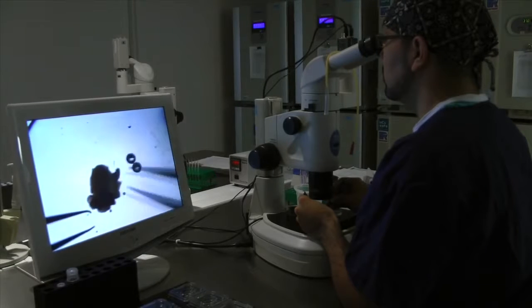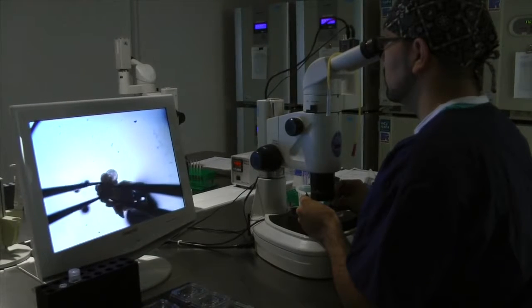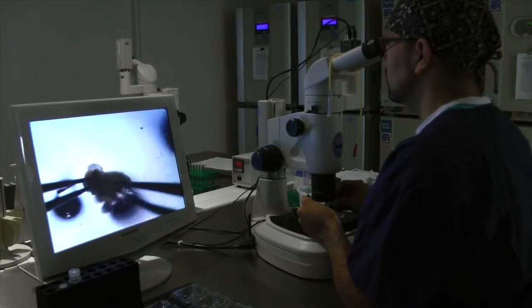I've been working in the MEA lab since 2008, and our mission has been to create the most sensitive MEA assay possible to ensure the quality of the products that Vitrolife is producing. MEA is a mouse embryo assay, and it's utilized to detect toxicity in compounds and to assist us in evaluating the quality of the media that's manufactured.